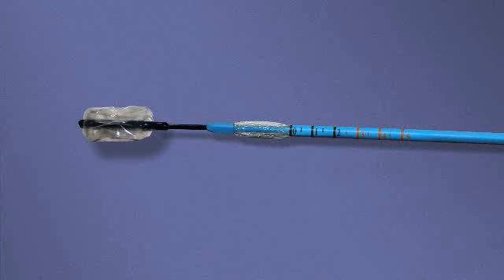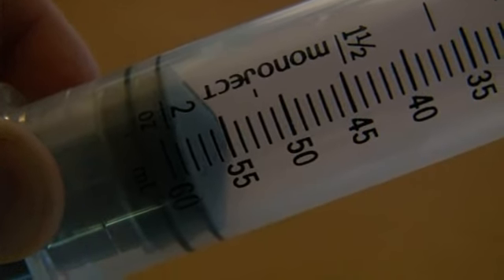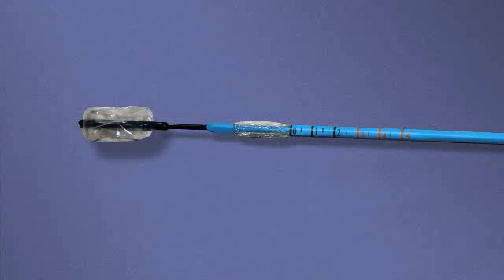If you see that pressure readings are not being registered and you see mostly blue indications, stop the test. Inject 10 cc's of air to get an initial reading, and then the rectal balloon will once again be able to register pressures.